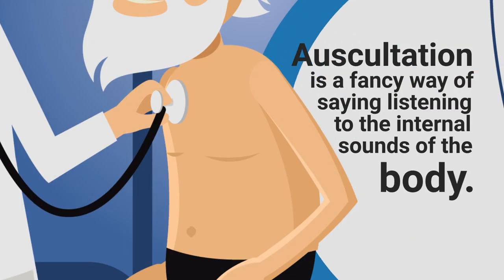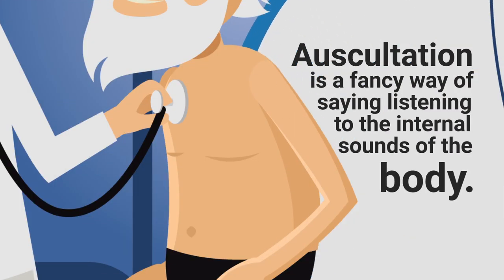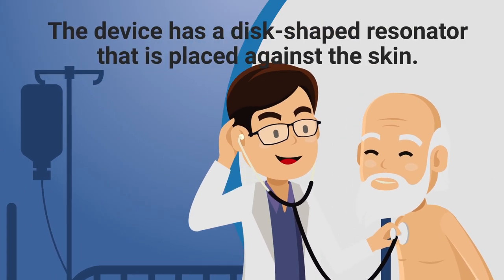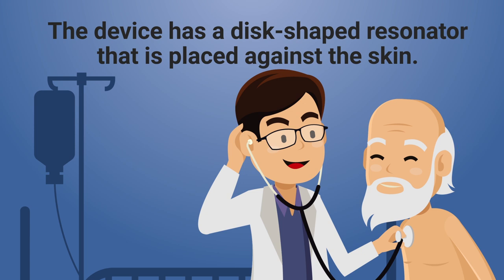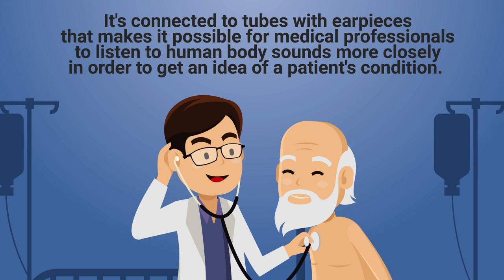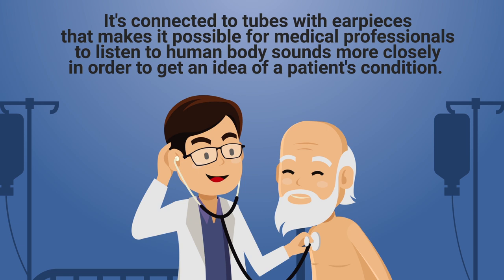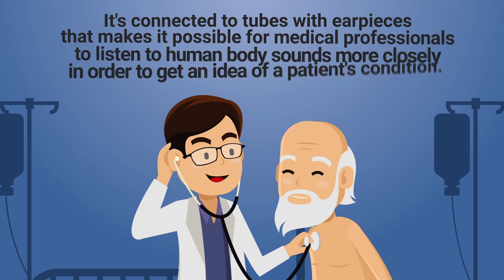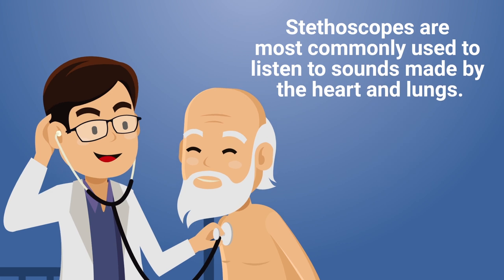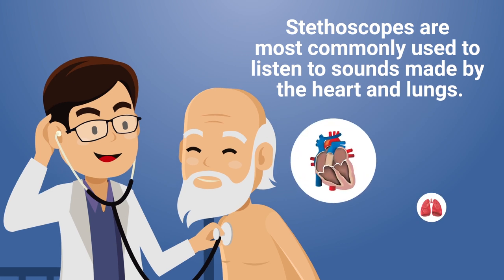Auscultation is a fancy way of saying listening to the internal sounds of the body. The device has a disc-shaped resonator that is placed against the skin, connected to tubes with earpieces, making it possible for medical professionals to listen to human body sounds more closely. This gives us an idea of the patient's condition. Stethoscopes are most commonly used to listen to sounds made by the heart and lungs.